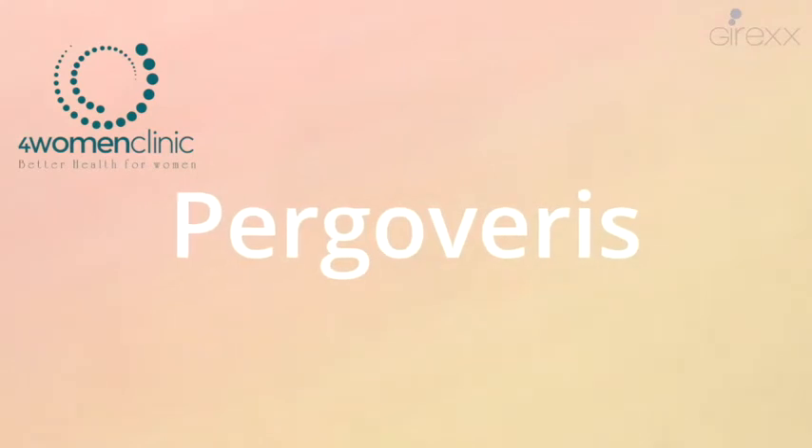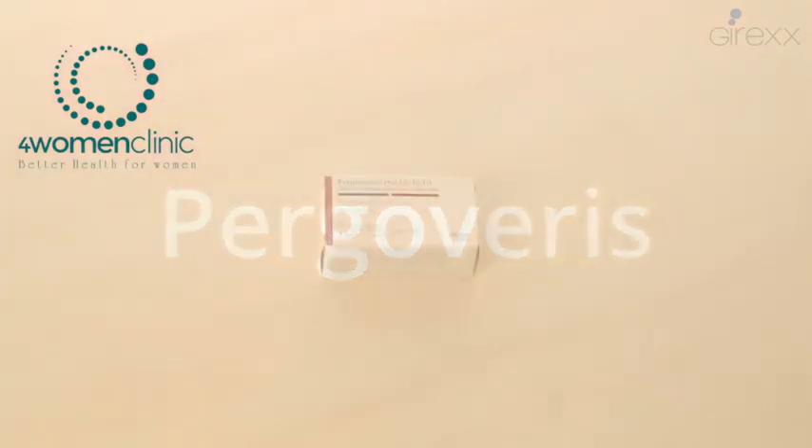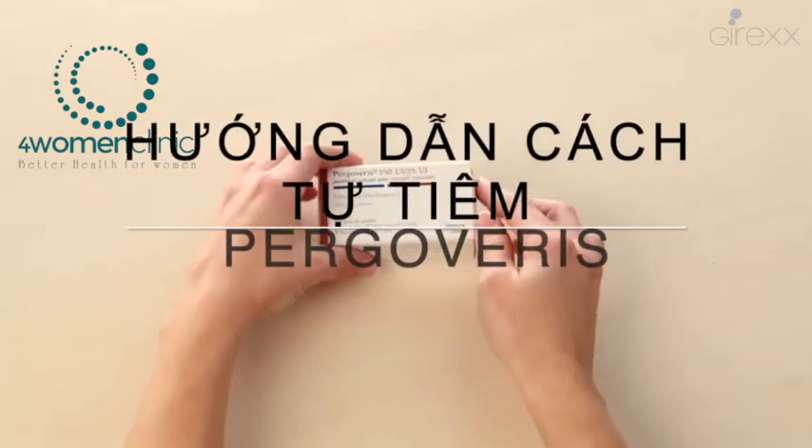Instructions for the use of Pergoveris. Before you start, wash your hands carefully.